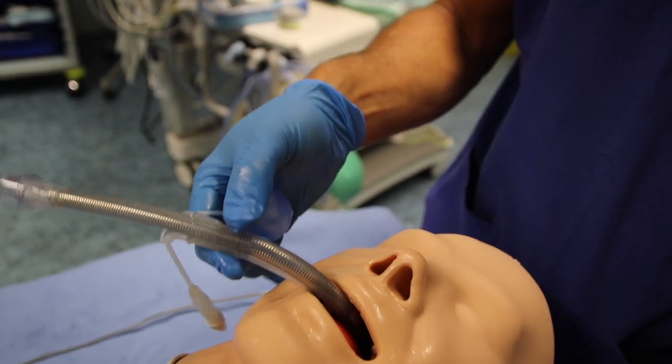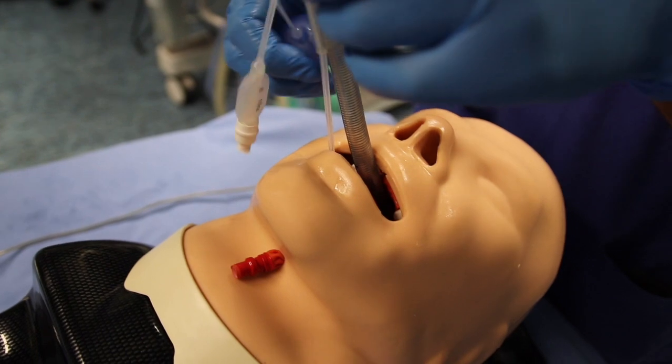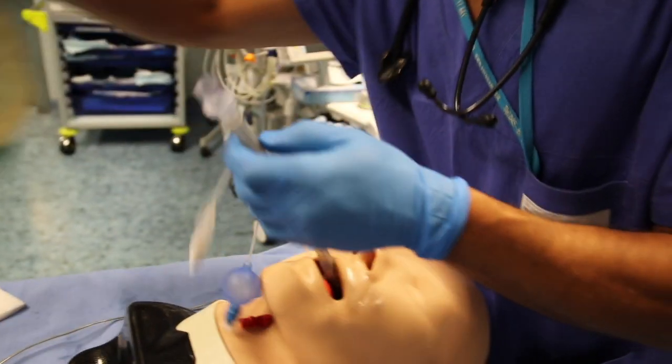Wait until the tube adjusts itself. As you can see, here it is coming out slightly. Once it gets stable, you can start ventilating the patient.